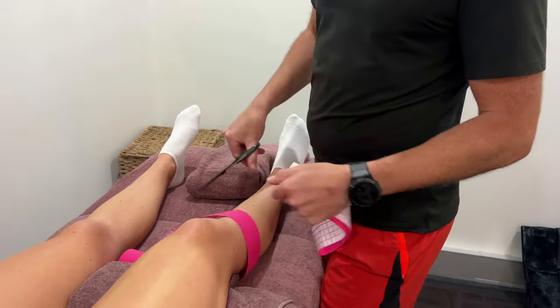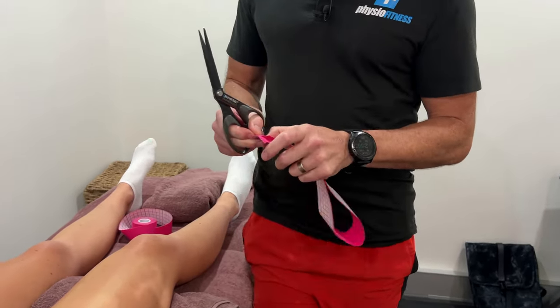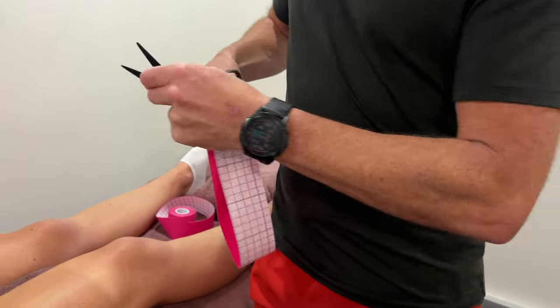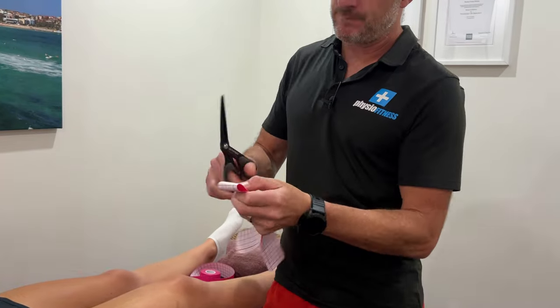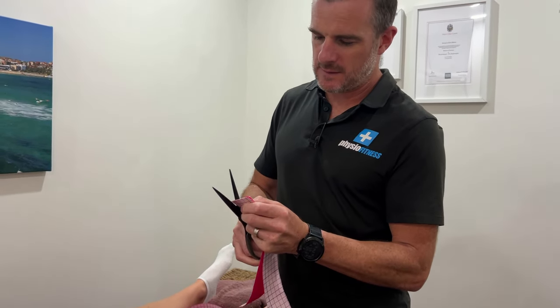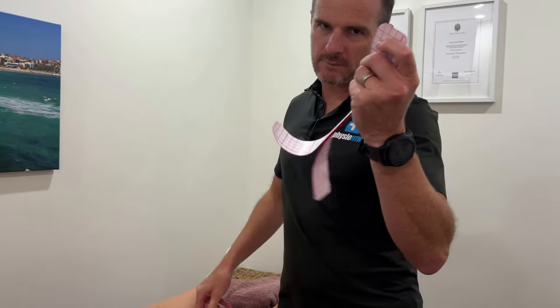Chop it off wherever you want. The trick with all kinesio taping is to round those edges off — that means it doesn't get caught on material or things and doesn't come off as easily. So cut through one end and do the same on the other end. Now you've got two lengths exactly the same with rounded edges.